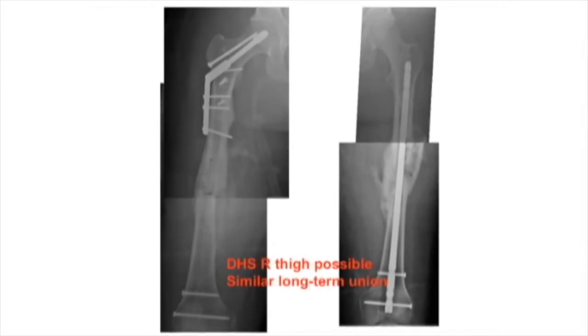So technically, femoral nails with the carbon fibers, have you done a head-to-head? Well, in our N of 1, it seems pretty promising. It's just very hard to be able to do it in the same patient. If you're talking about just being able to compare two different patient groups, we're trying to get the numbers. But right now, based upon our preliminary data, anecdotally, and mind you, it's still very early, what we were trying to investigate is a couple things. One is callus volume. Number two is rate of callus formation in terms of time.